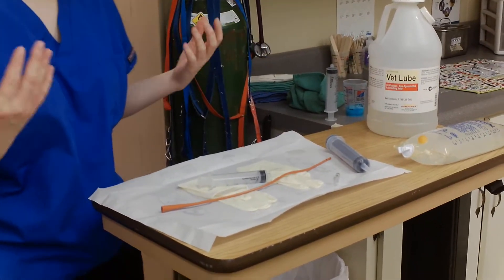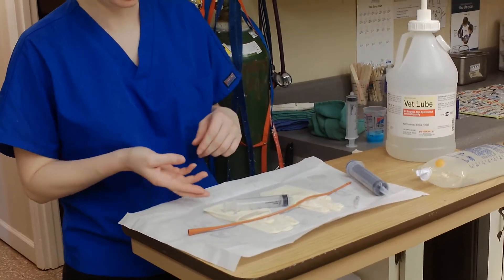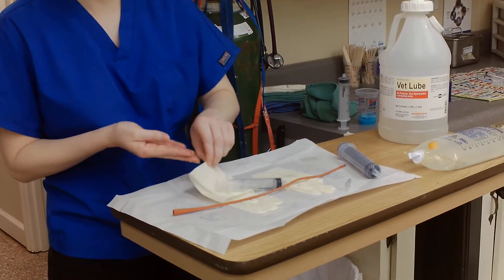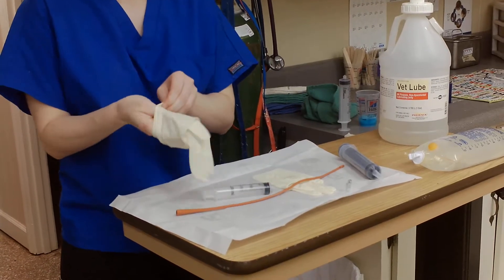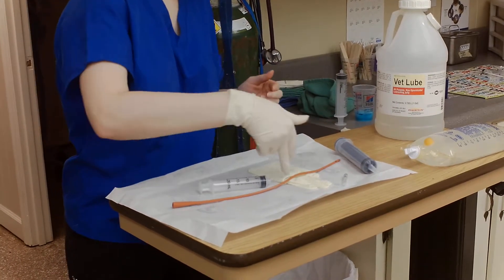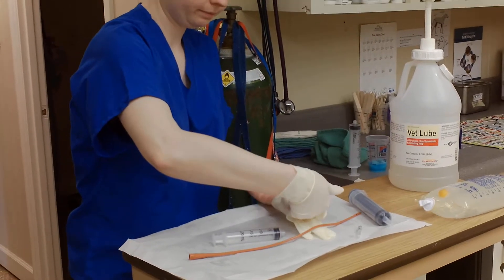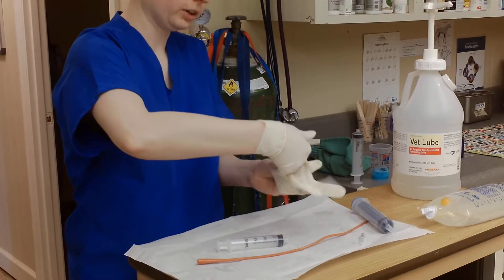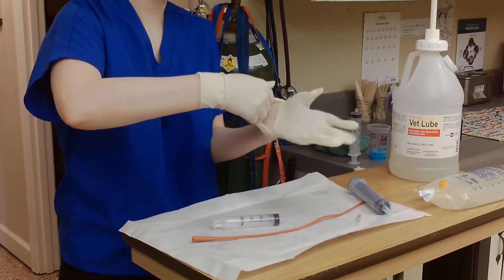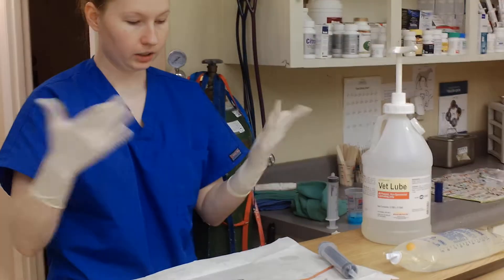At this point I will go ahead and scrub in so that my hands are clean. As far as gloving in, you can grab the inside of the glove and work your hand in. Leave your cuff alone. Grab the inside of the other cuff of your other glove and work your hand in, to each correct full of your fingers. And then you would fix your other one if you wanted to.